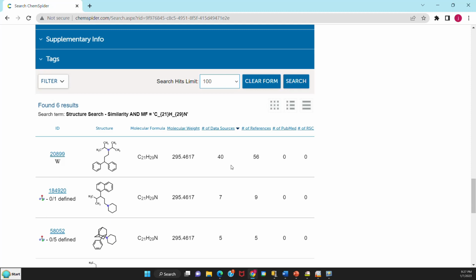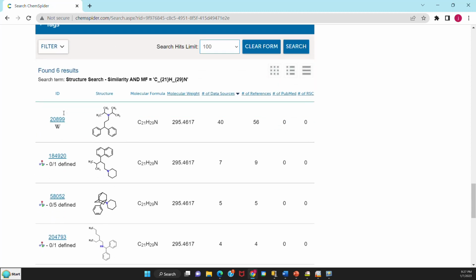All right, the results have come back, and you can see now we only found 6 with the Tanimoto filter opened up to 50. If we'd have driven it up toward 80 or 90, we probably wouldn't have found all the results we need. And this is a reasonable number to look at, so it's better to be cautious and err on the side of getting too many as opposed to cutting out something of interest.